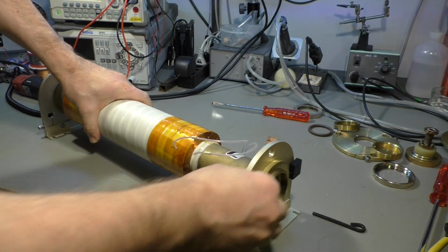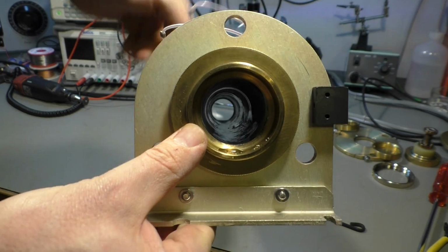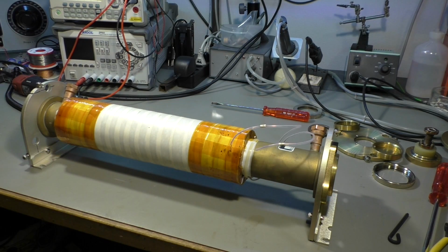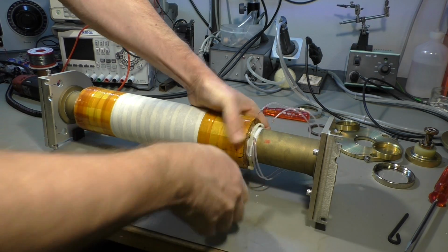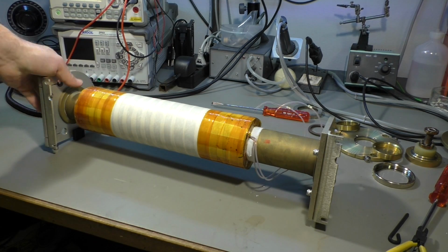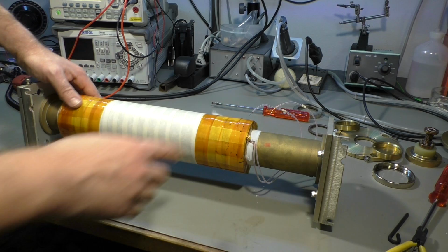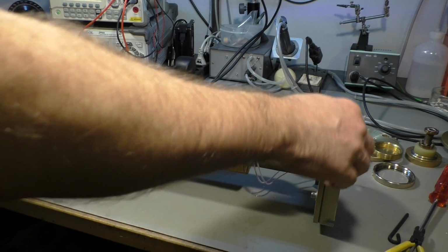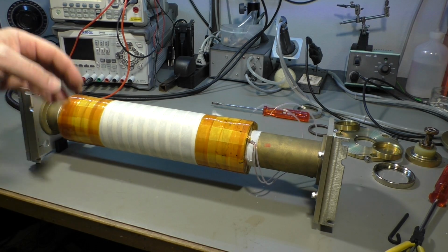Okay, how does it look? Well, just a brass tube with fittings, and there is a gap between this tube and the laser tube, and the water is running through that gap. Okay, some cable ties. So I think, because there is a flange, there is also a flange, so they probably wound the entire coil onto the tube, so I don't think we can move it away like that.